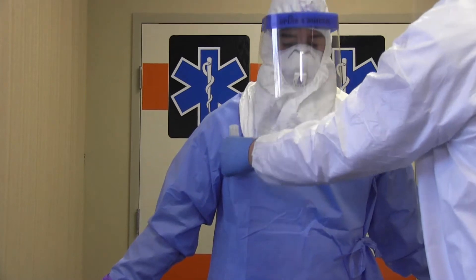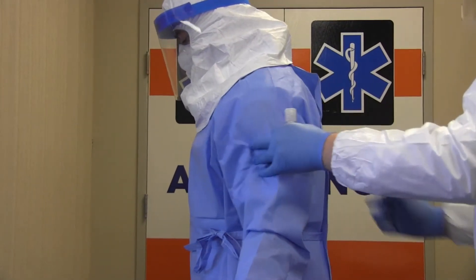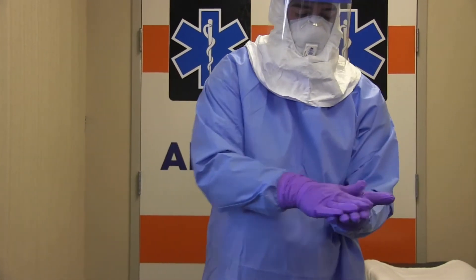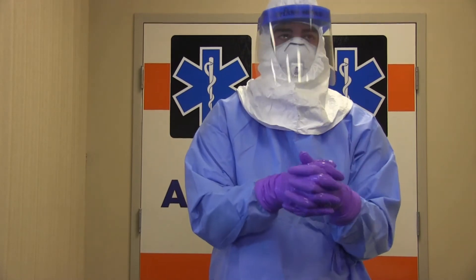After completing the donning process, you should ensure that you can move comfortably and have a full range of motion. Your trained observer should ensure all PPE has been donned appropriately and any corrections can be made at this time. Once all the PPE has been donned appropriately, disinfect your outer gloves with an alcohol-based hand rub and allow it to dry prior to patient contact.